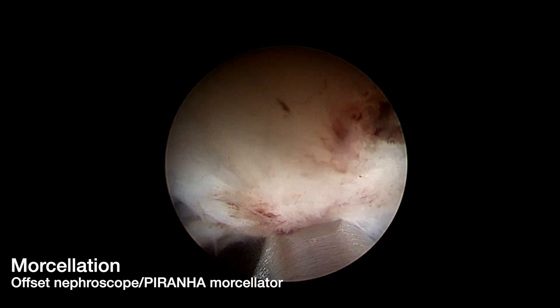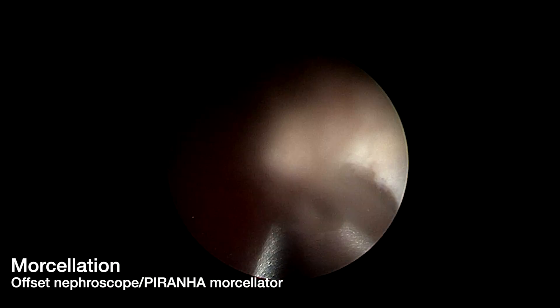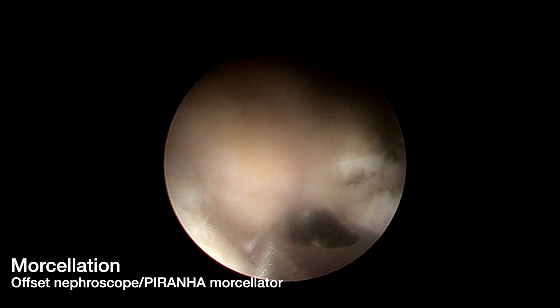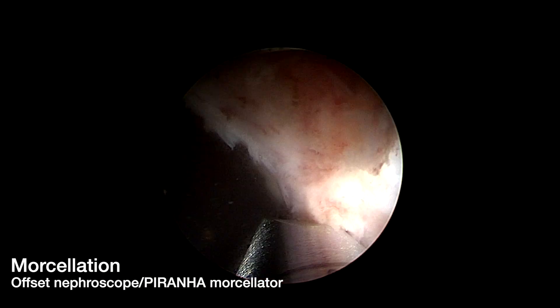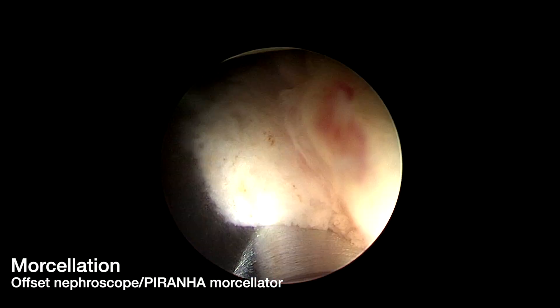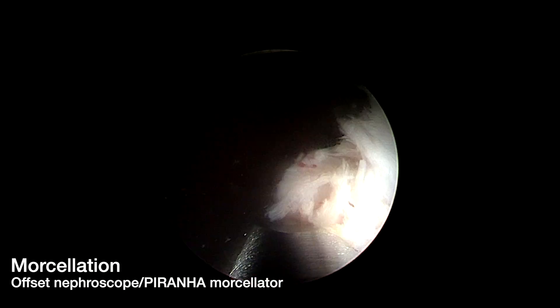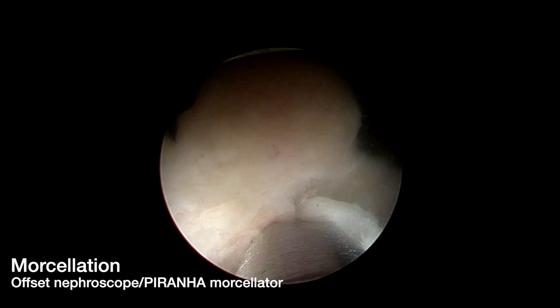The laser resectoscope is then exchanged for an offset rigid nephroscope. A soft tissue morcellator — we use the Piranha Morcellation System by Richard Wolf — is placed through the straight working channel of the nephroscope for adenoma morcellation. It is critical that a full bladder is maintained through the exchange of rigid scopes and the entire morcellation process, as decompression can lead to hemorrhage, decreased visualization, and bladder injury. Accordingly, we use a secondary irrigation channel.